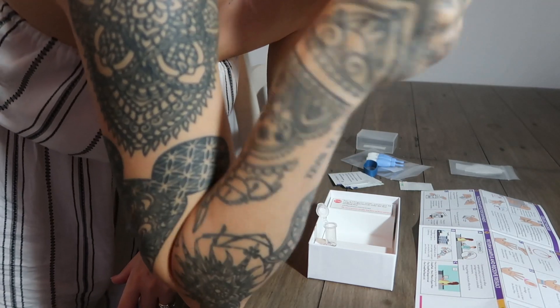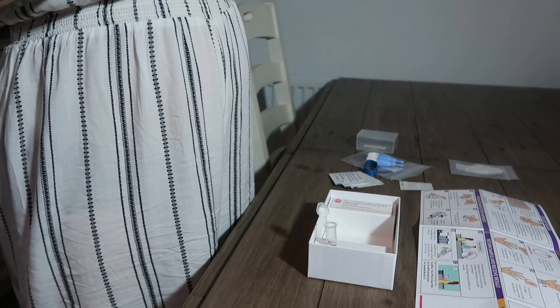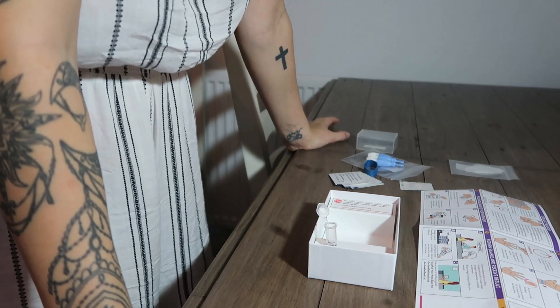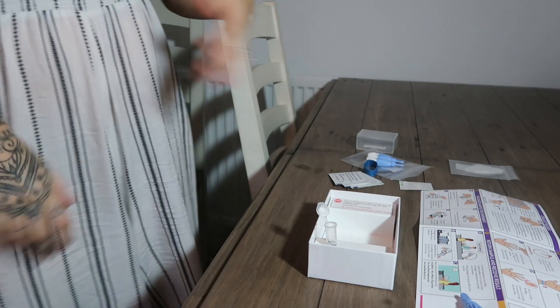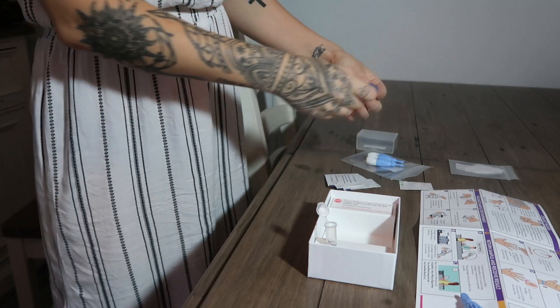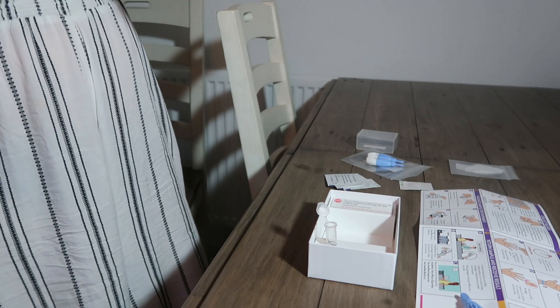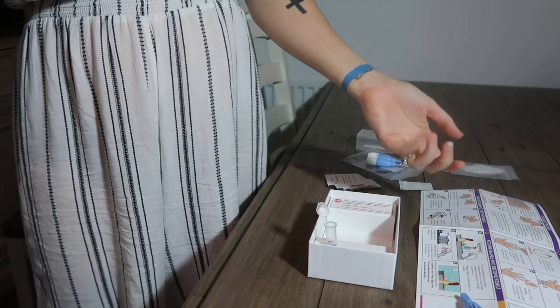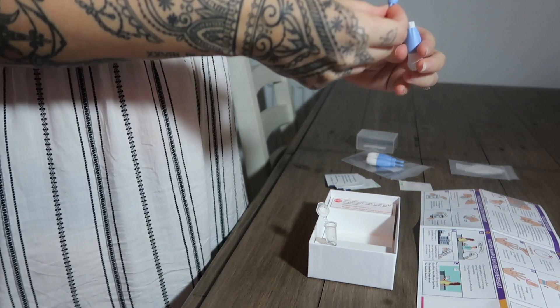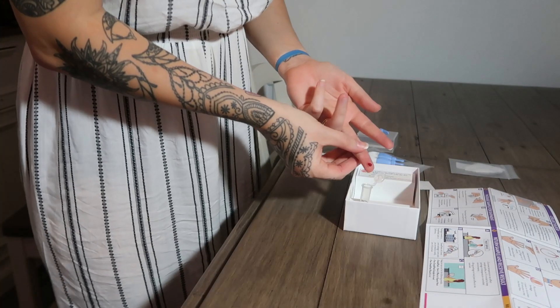Once you've done it, you close the lid and mix the sample. So you push this on your finger. Where do you click it? You just push it down and it clicks eventually. Is it going to hurt? No, it's not going to hurt. Why would it not hurt? I'll have to start again. I can't do it. Can you do it for me? I can't hurt myself. It doesn't hurt - you just push it on, there's no needle, you can't see a needle or anything. I'm going to be sick. Okay, so the band is on. I'm going to just twist this. You just push? I can't. I want to cry.